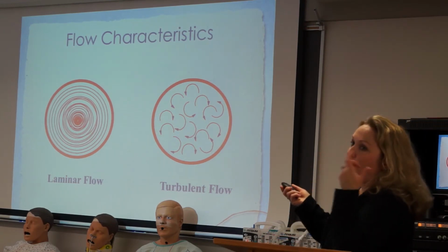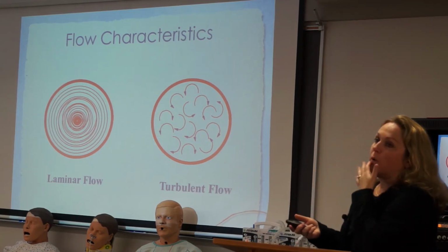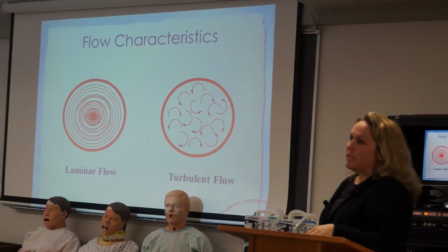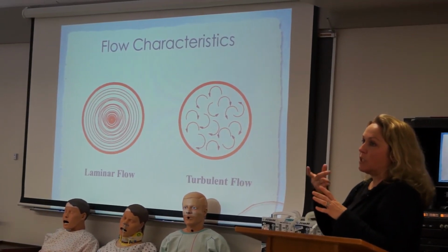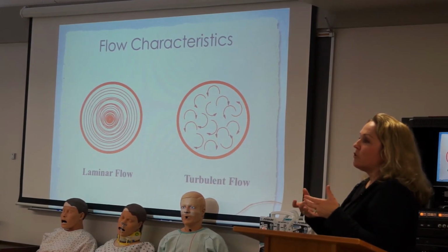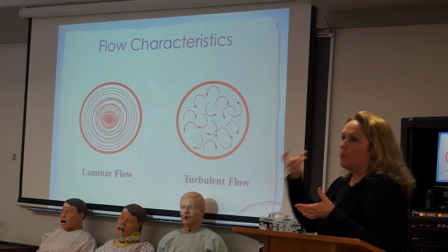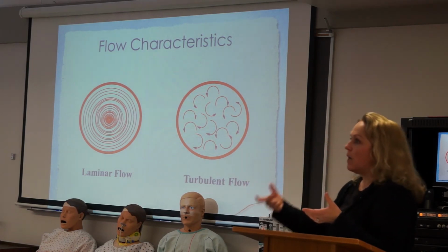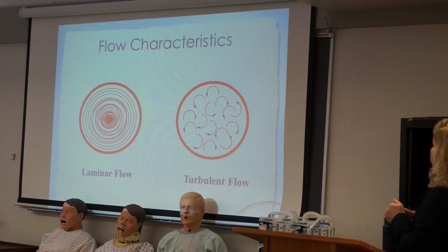You have laminar flow, which would be like a slow push. And then we have what's called turbulent flow. And when you're flushing these, it needs to be a stop-start. Have you guys heard of that before? The stop-start for flushing? With central lines, it really needs to be push, pause, push, pause, push, pause, all the way through your 10 mLs of saline.